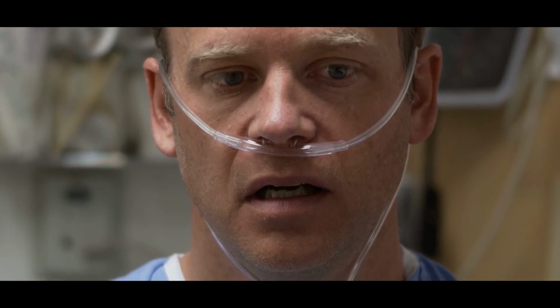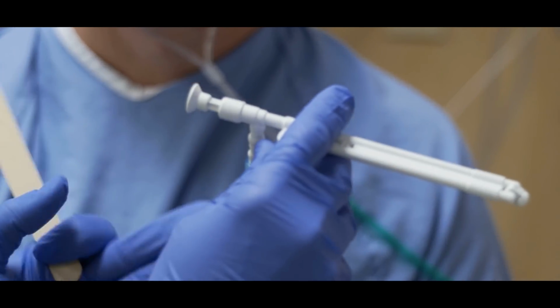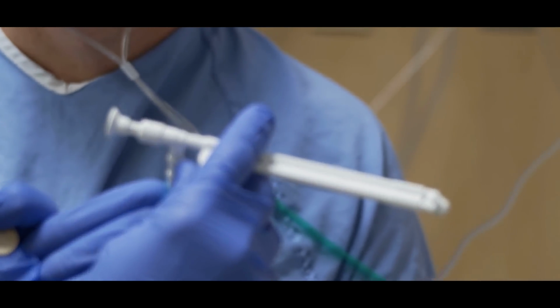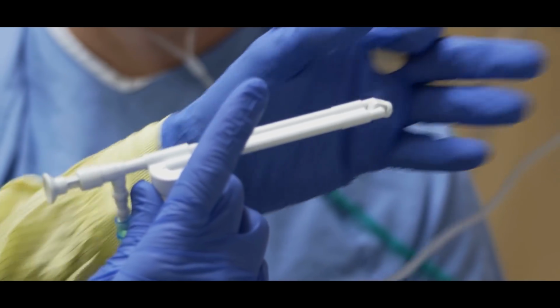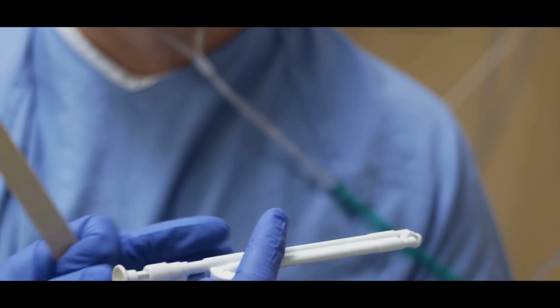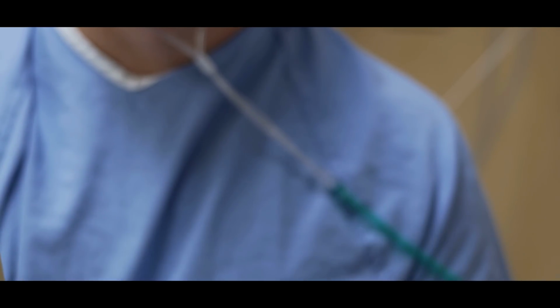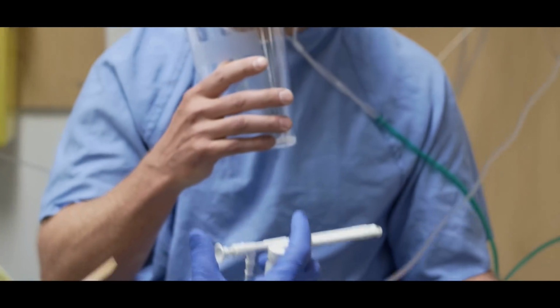This is a very simple device, you put your product in here, and it doesn't have to be oxygen or air flow, simply by depressing this button, it atomizes. If I've used the term nebulize up to this point for this device, that's not correct. It atomizes it, so it forms slightly larger particles, again, that will rain out in the upper airway.